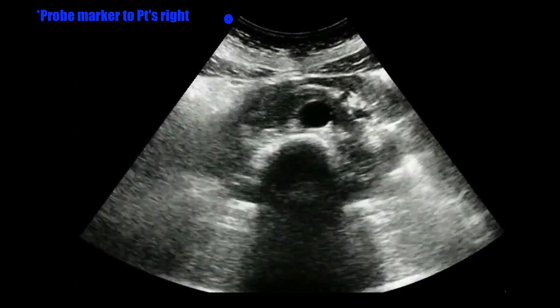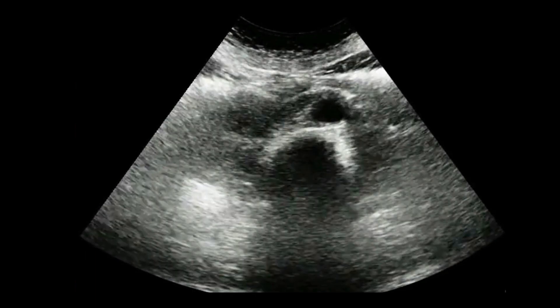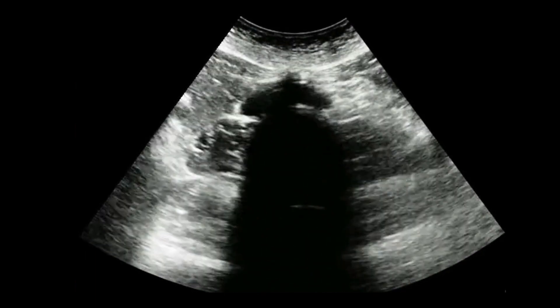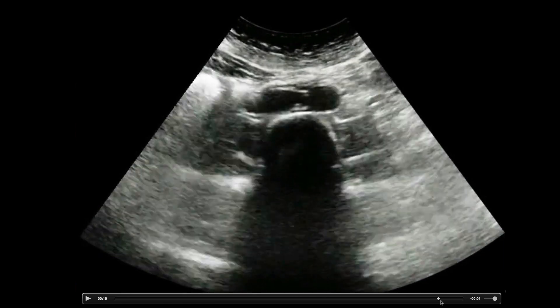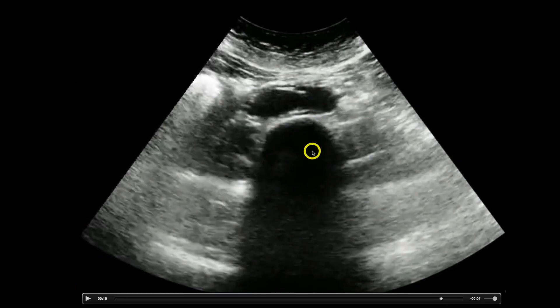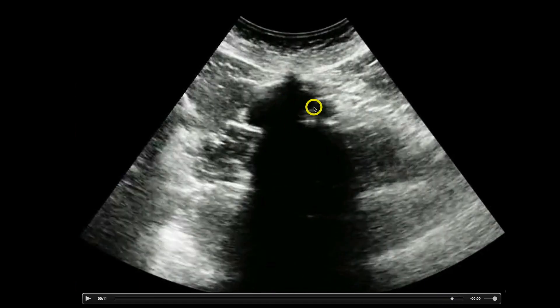You can measure it all the way down. We want to know: is that aorta dilated? We want to evaluate it from the beginning of the aorta — basically as high up as we can find it — all the way down until we get to the branch of the iliacs, which you can see right there where it splits.